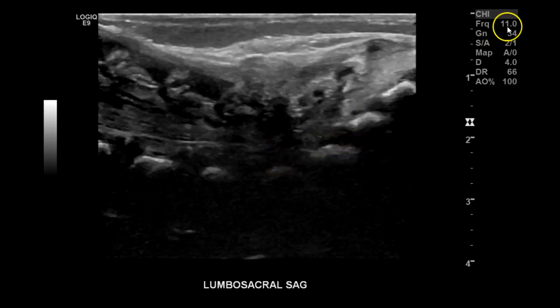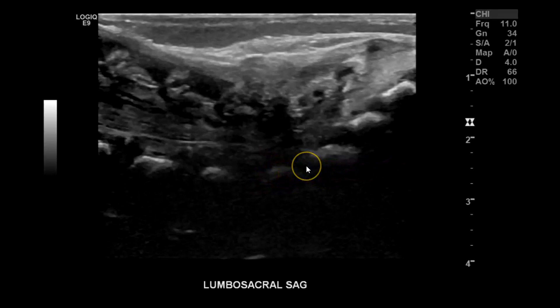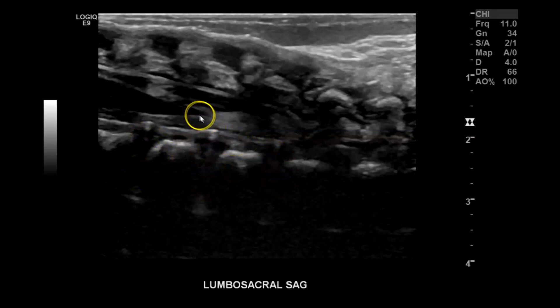Here you can lower the megahertz — I have it at 11, but you can lower it to 10 to see a little better, or go back to 9 if you're having trouble. Here's the lumbosacral region. You can see the lumbar vertebrae — they're usually trapezoidal in shape. These are the intervertebral disc spaces, and here you can see the conus medullaris and the cauda equina.